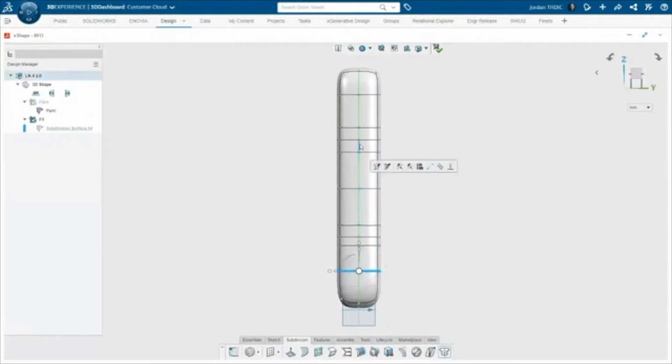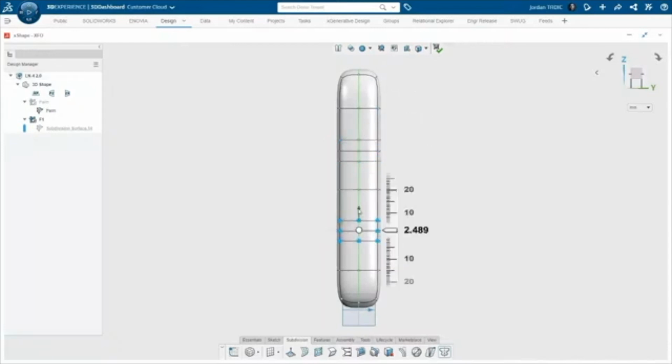Another keyboard shortcut is if I want to select an entire loop of entities, just double-clicking an edge will do that. So I actually wish we had that one in SolidWorks. Double-clicking an edge selects an entire loop of entities. That'd be nice. It's pretty convenient.